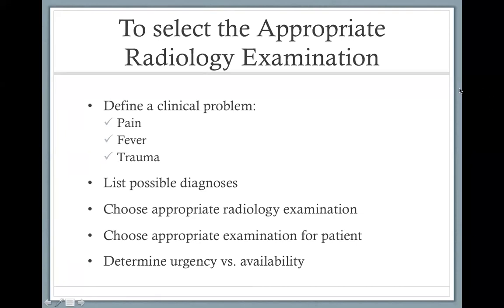And then we will sometimes do an initial imaging modality. For example, the case I just have shown you with the pneumonia and empyema. Most likely the patient had the chest X-ray, but the patient was not improving, and then you end up doing the CT.